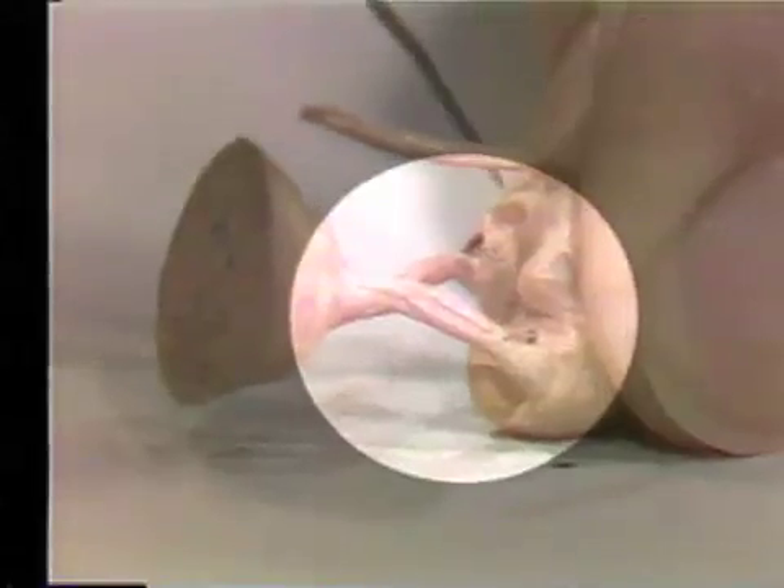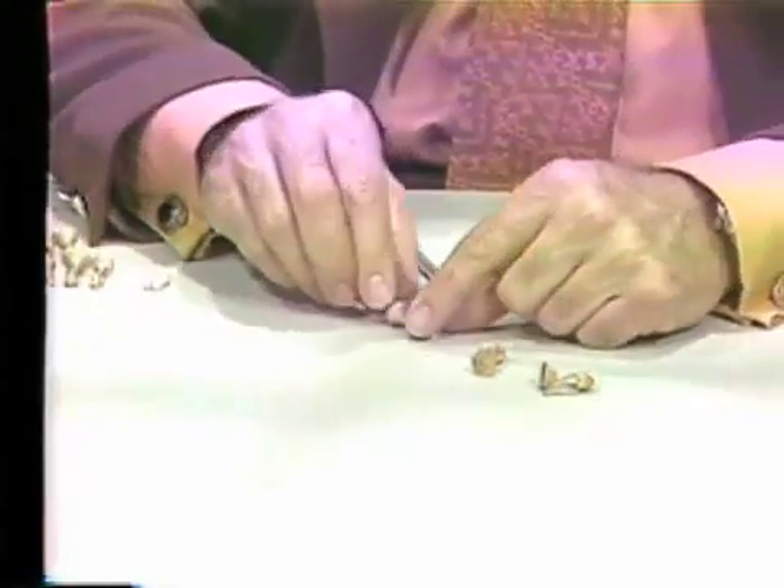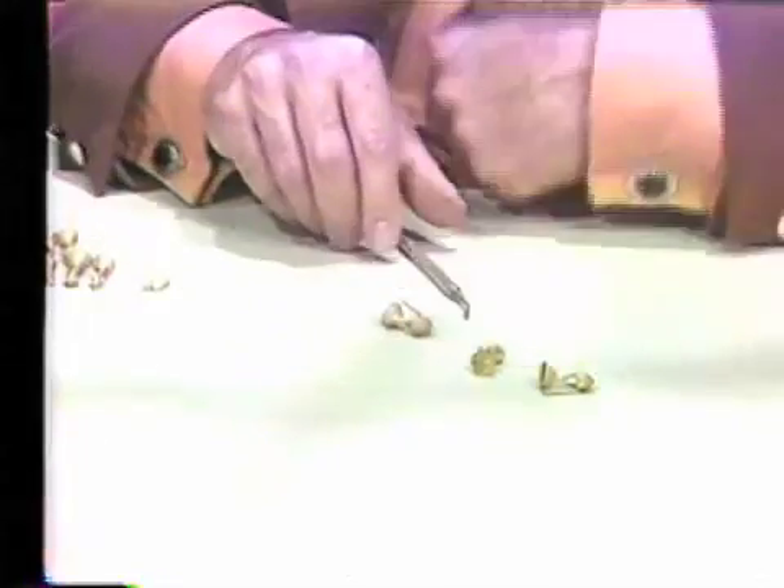One may say that if the sprue length were a little bit shorter, there would be a better chance of feeding the pontic. In the next case, that is exactly what has been done.